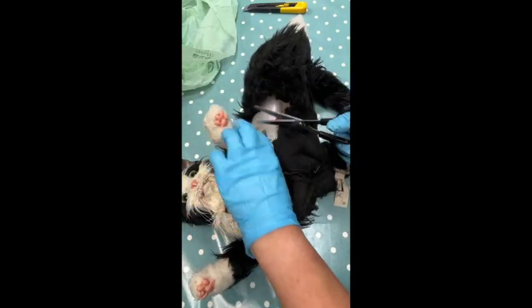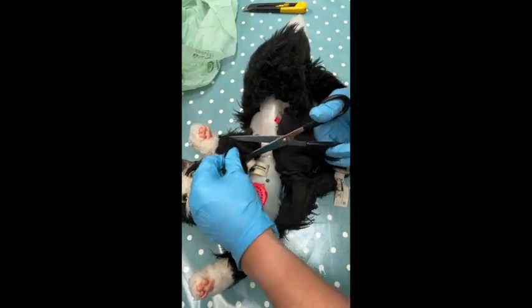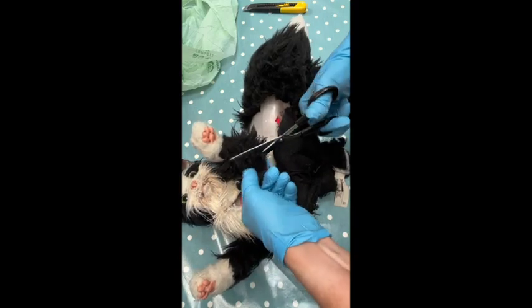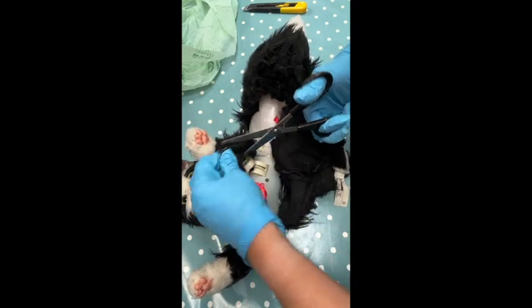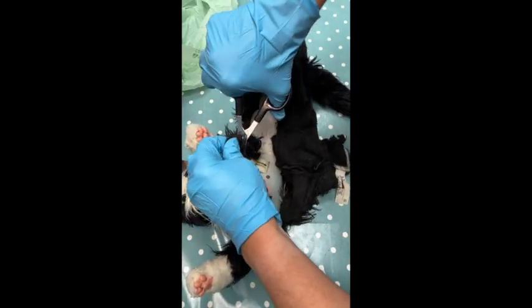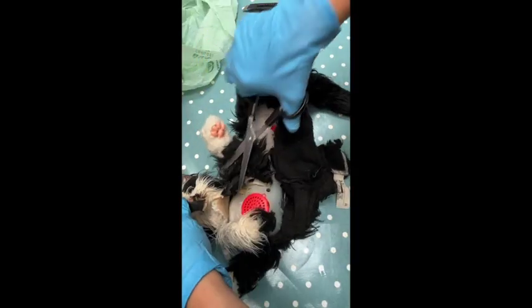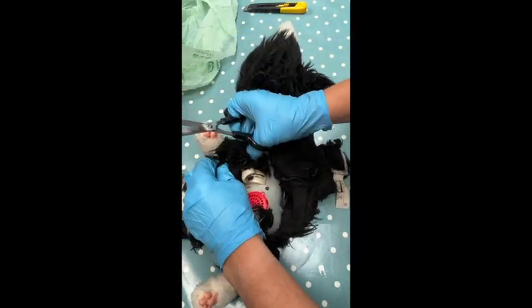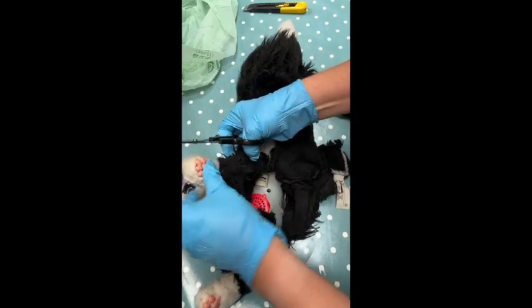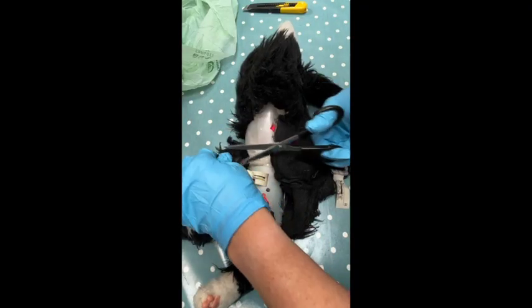It's gone into it. I'm going to try cleaning it off on the fur before, as they say on the website, just to use the wipes. I've used some pretty heavy duty ones as well, and haven't really touched it. Just made it wet and then smell even more. So it's just embedded. I don't know how I'm quite going to get into here. We need some stronger scissors.